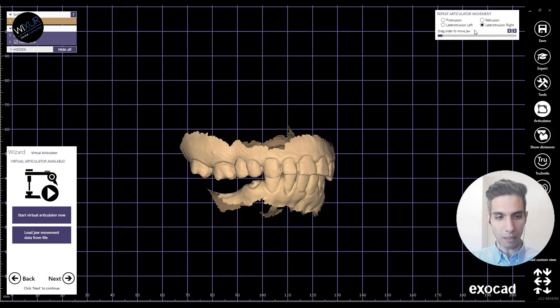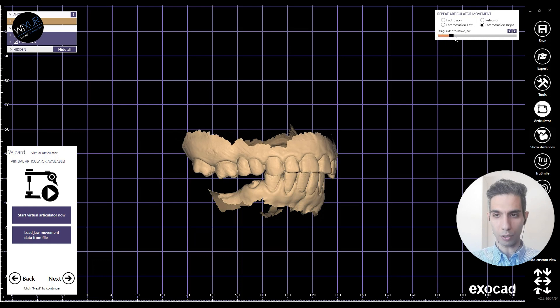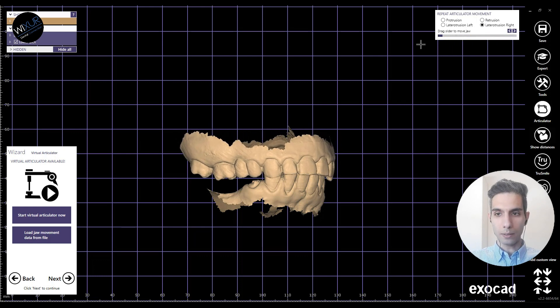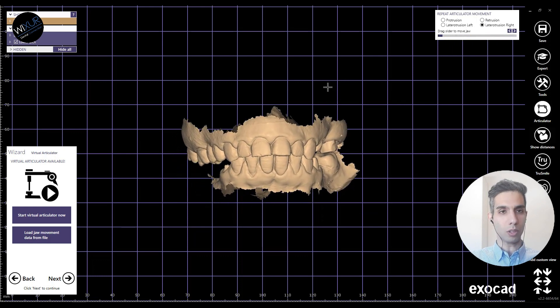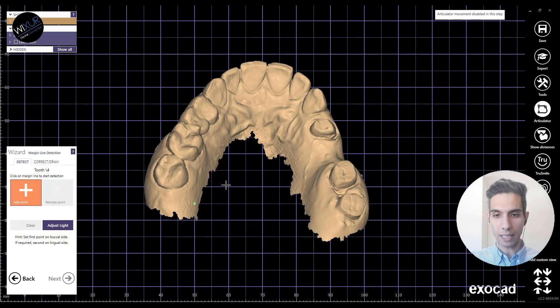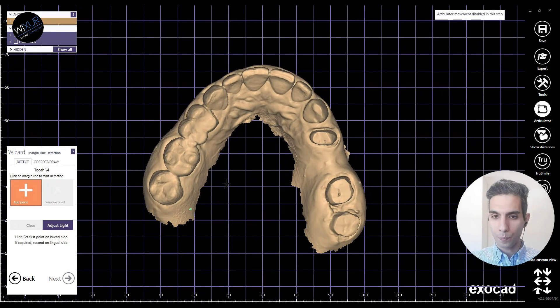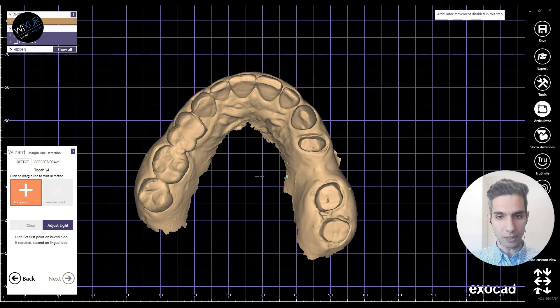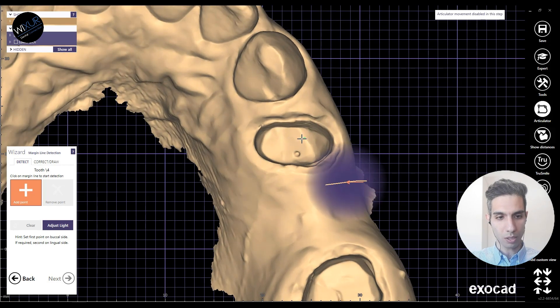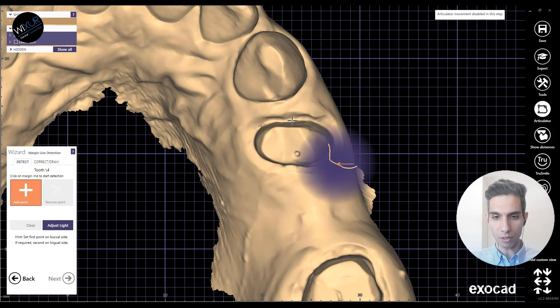I explain the articulator add-on module completely in detail in the Exocad workshops that we have, so we can check them there. Now let's start with the outlines — the margin lines of this model.